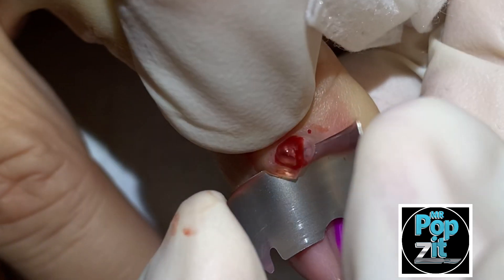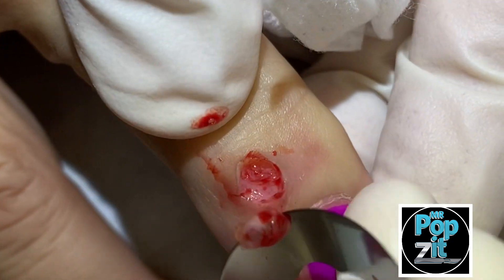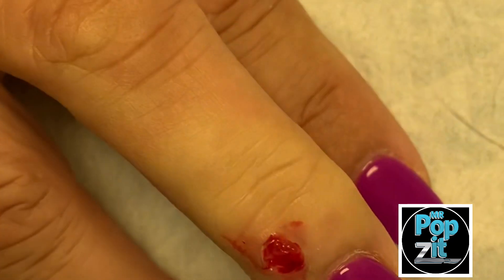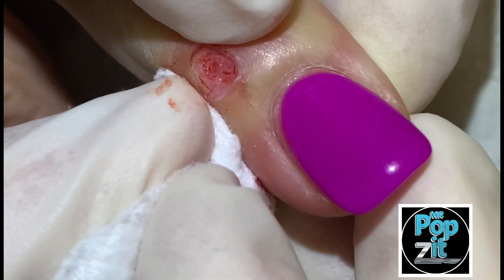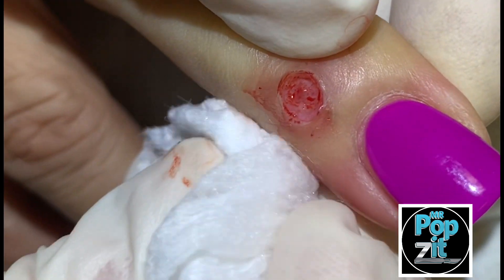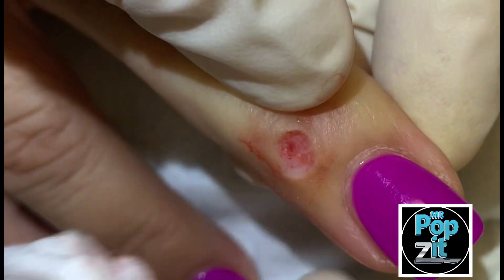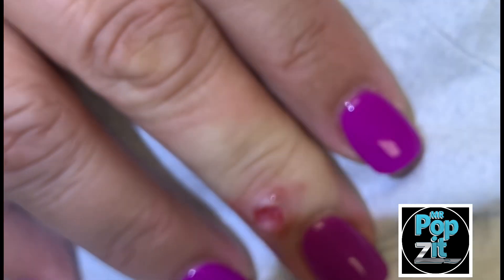Go down just like a little wedge cut there so we can cauterize a little deeper here. And you can see that where it's coming out, we're going to cauterize that base. Now if this comes back from this procedure then sometimes they have to go to an orthopedic hand surgeon that will get deeper into that joint to make sure it doesn't come back. But we're going to do some cautery here to burn out that little area where it comes up, and that should stop it from returning.